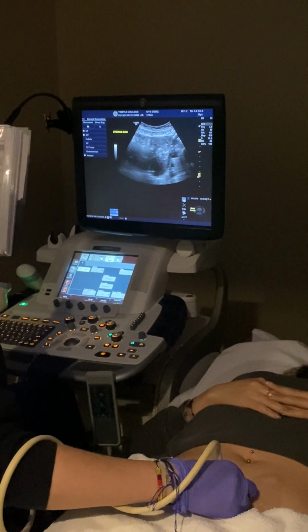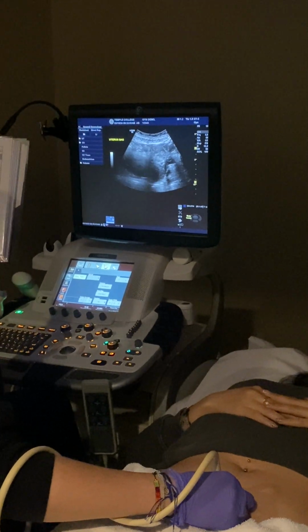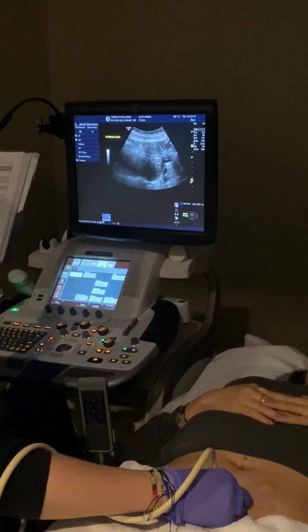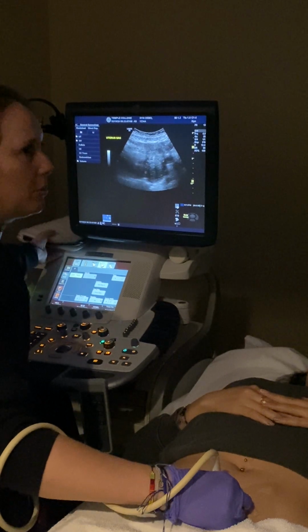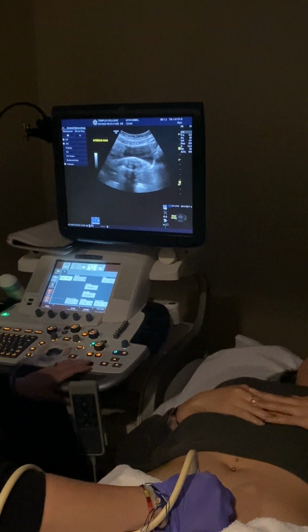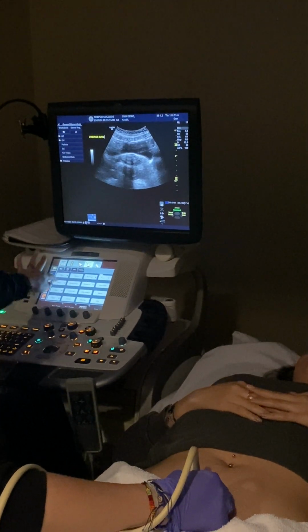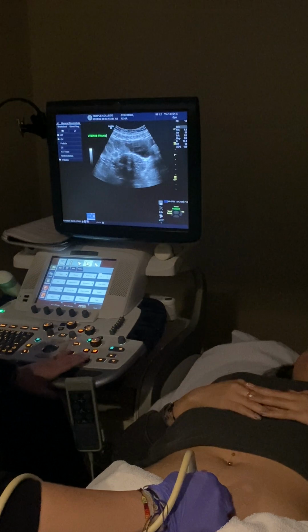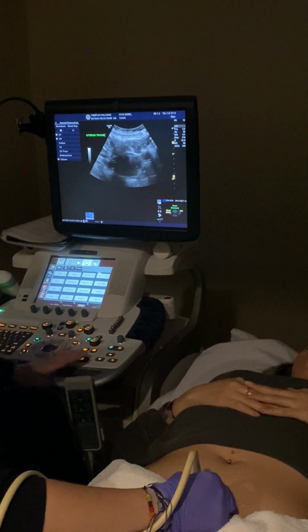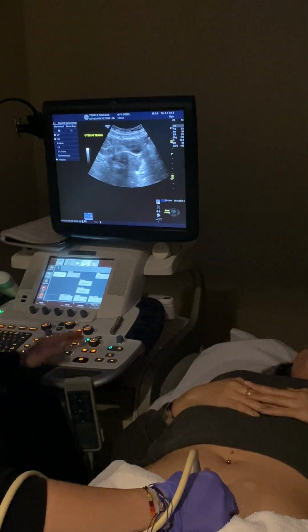We're doing a superior to inferior, but it's labeled lower uterine segment, body, and fundus, instead of like a superior, mid-inferior. So lower uterine segment is gonna be right up from that cervix. So transverse cervix, and we're just gonna go up, and this is that lower uterine segment here. I'm gonna fix this a little bit, because there we go. You guys see it?